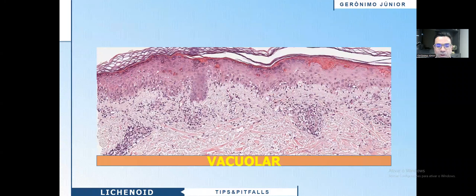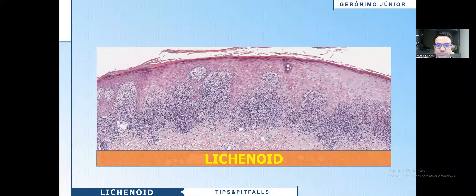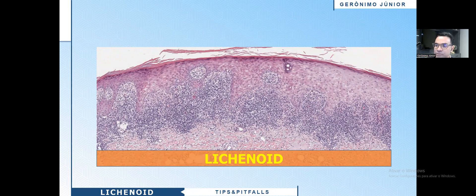Here is an example of Vacuolar Dermatitis, where you see vacuolization of the basal layer and interstitial and perivascular infiltrate. Here is an example of Lichenoid Dermatitis, when you see the dense, intense inflammatory infiltrate blurring the dermo-epidermal junction.